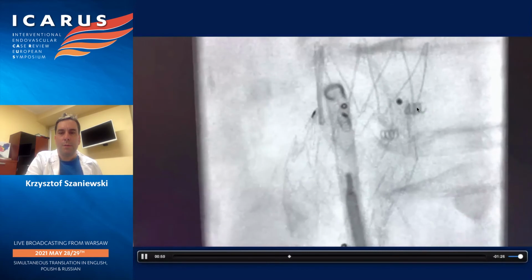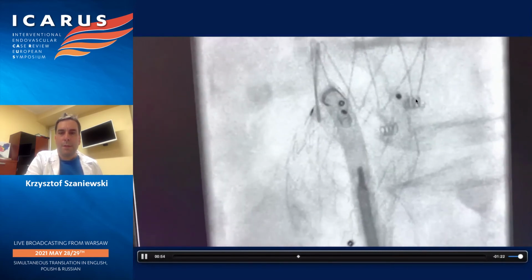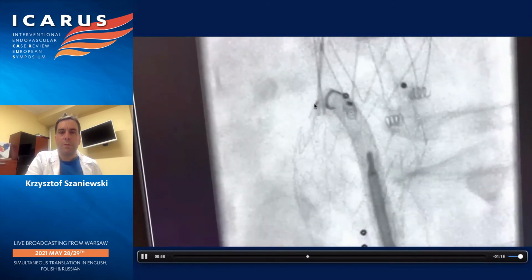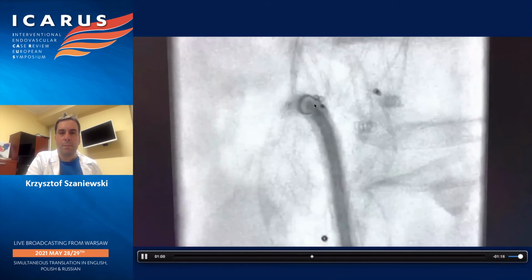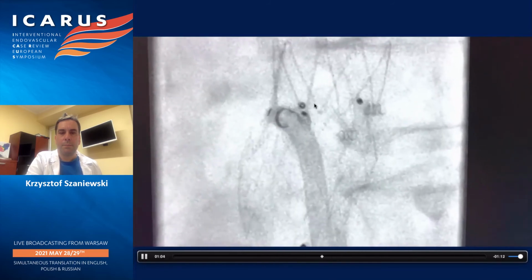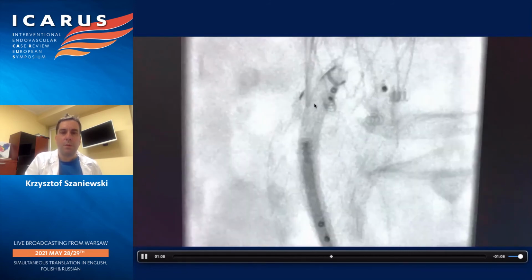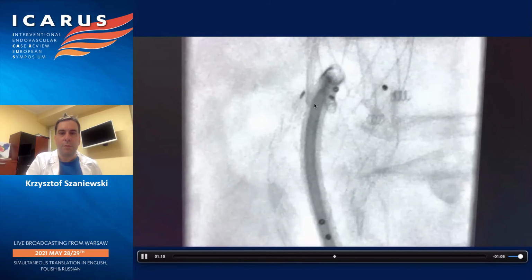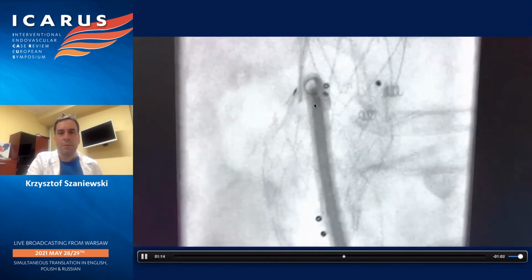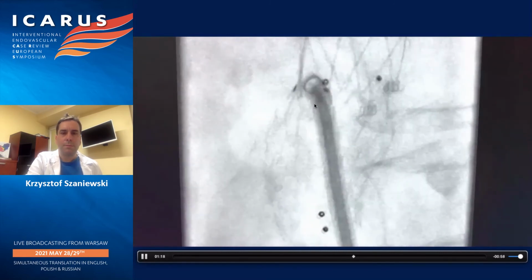We implanted the endostaple at the left, and now just below the renal at the right. It takes some time when you exchange the system because you have to reload after each screw. So this is the fourth screw, or endoanchor, implanted here.